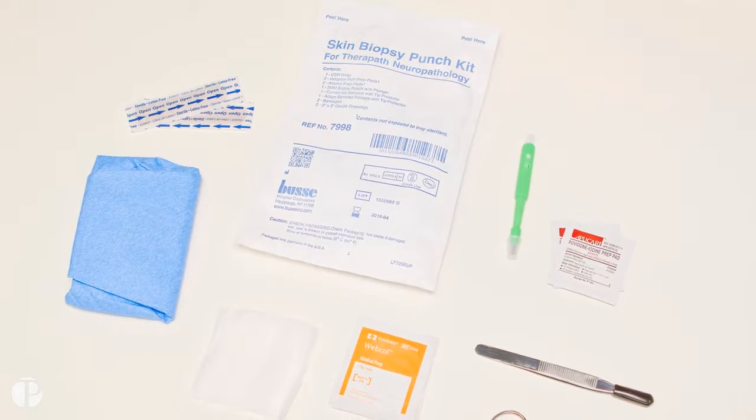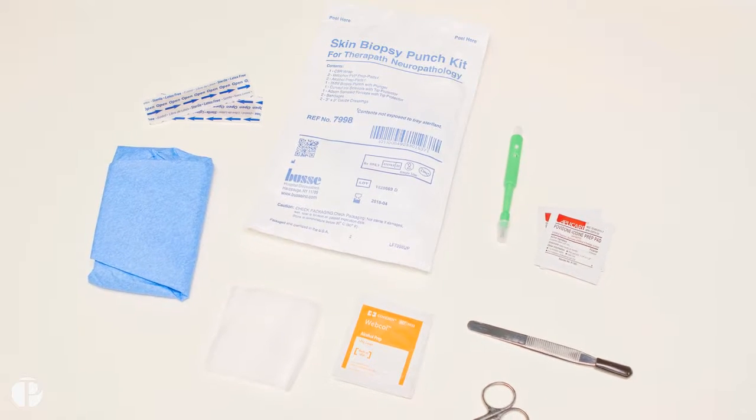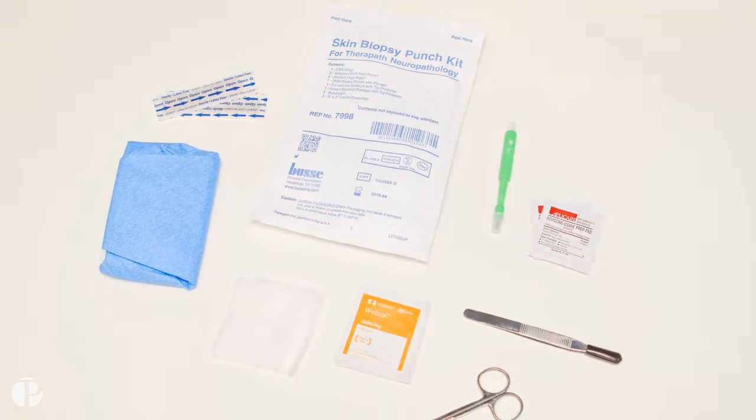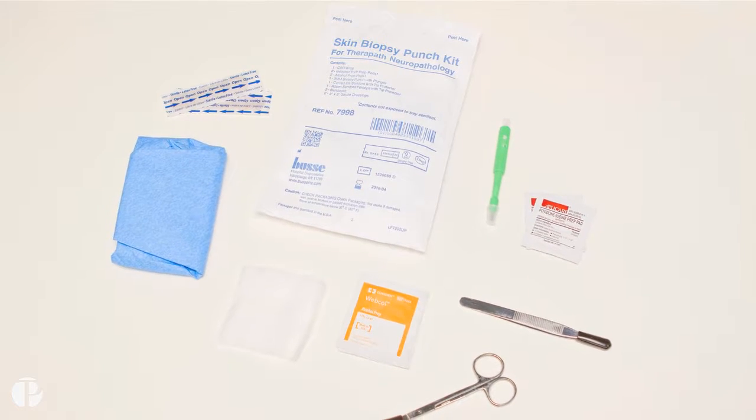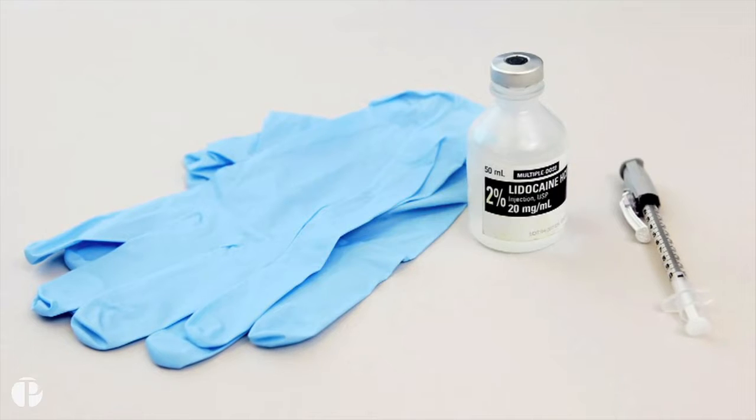The sterile skin biopsy punch kit contains adhesive bandages, forceps, a punch tool, scissors, alcohol swabs, iodine swabs, and gauze. You will need to provide gloves, 2% lidocaine with epinephrine, and an injecting needle.